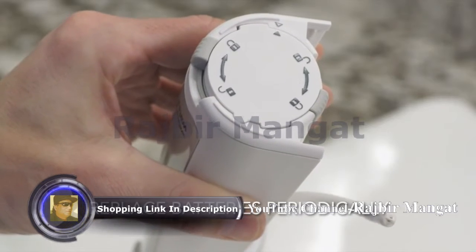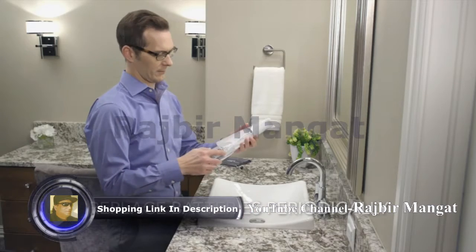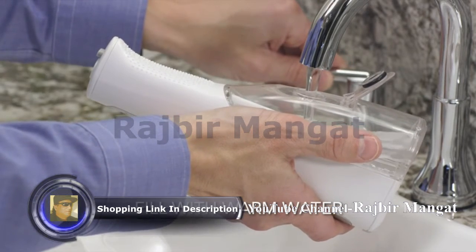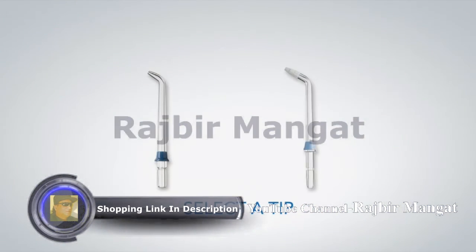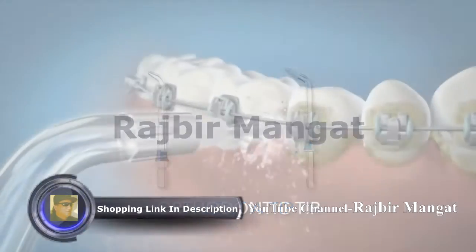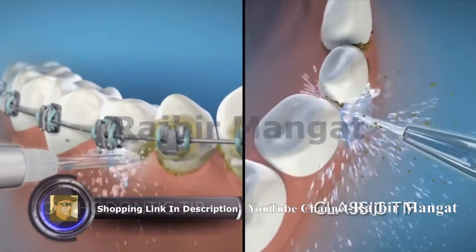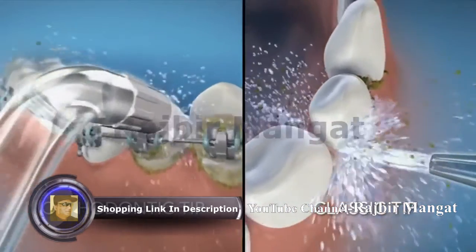Replace batteries when you notice a significant decrease in pressure. Now, reinstall the reservoir and fill it with warm water. Next, select the tip that is right for you. Our orthodontic tip is perfect for cleaning around braces, and our classic jet tip is best for general use.